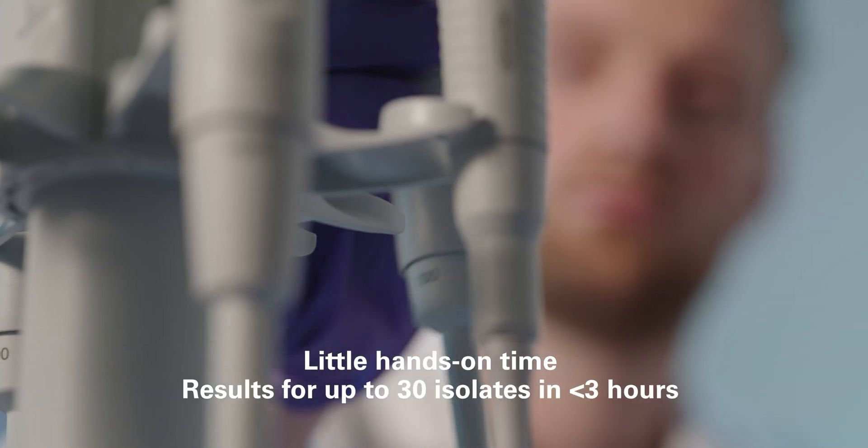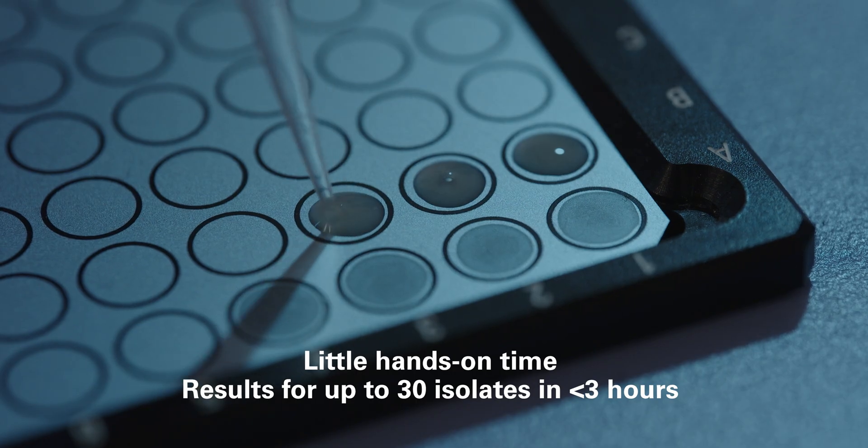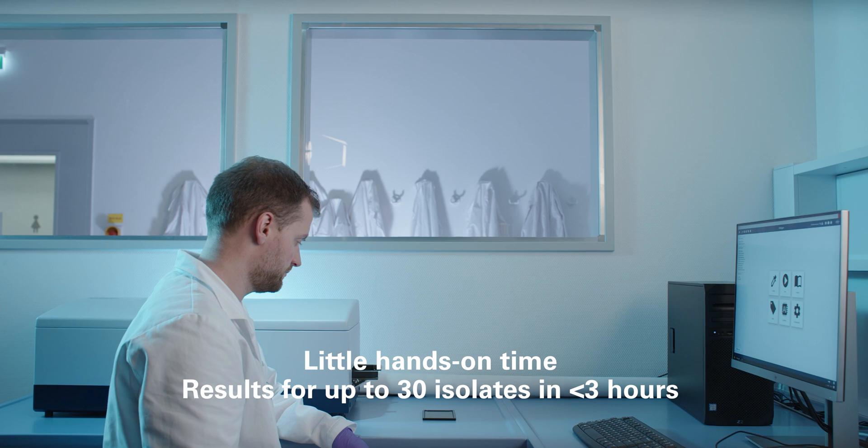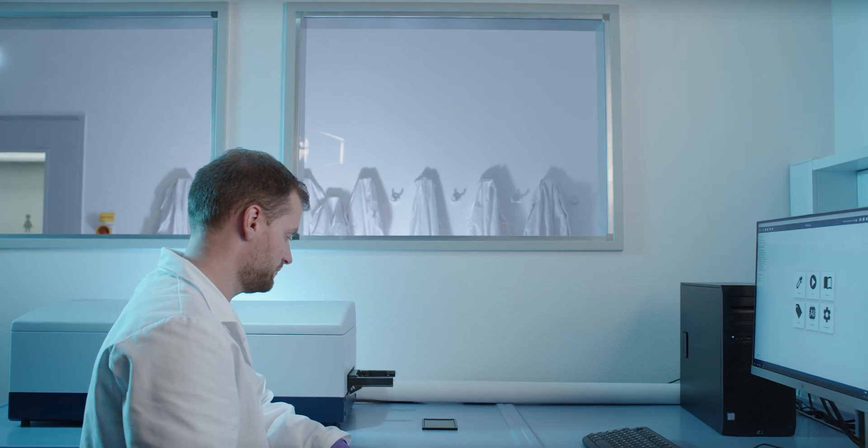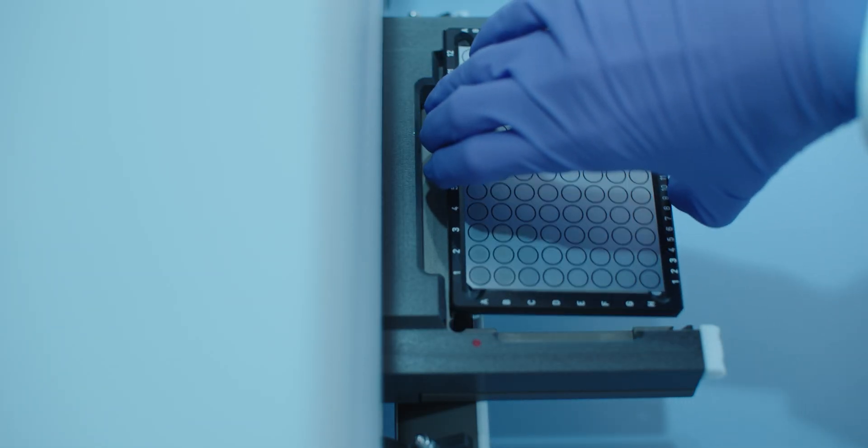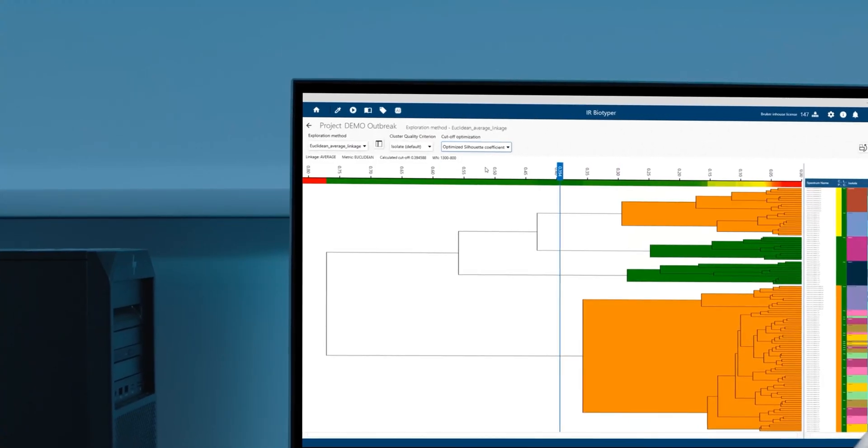After a straightforward sample preparation procedure that starts from a culture, the silicon plate is simply inserted into the IR Biotyper, and the analysis begins.